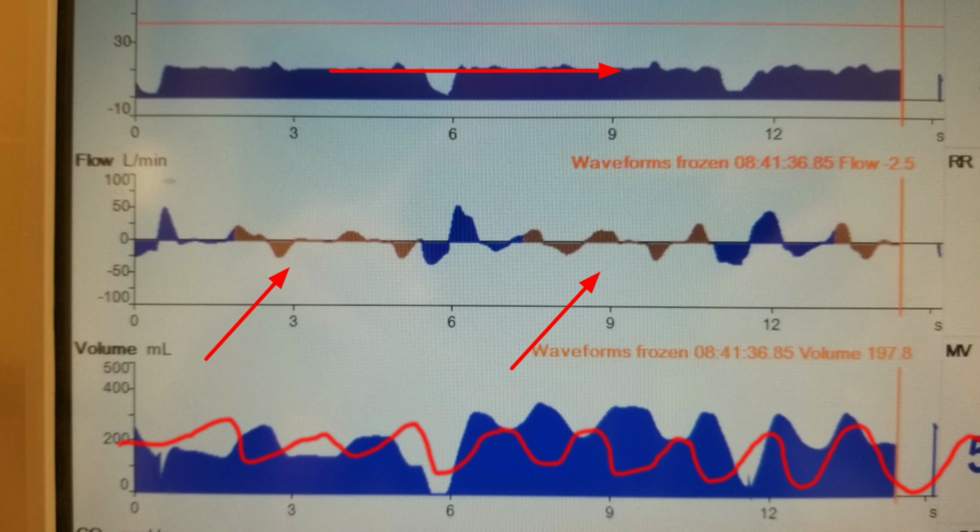So if that patient is pulling and you have very high amplitude flow time waveforms, they might be on the lower side of your pressure volume loop, and the patient is pulling, trying to recruit back the functional residual capacity. So sometimes you'll have a very high amplitude on the flow waveform when you're on the lower part, possibly not high enough with your P high.